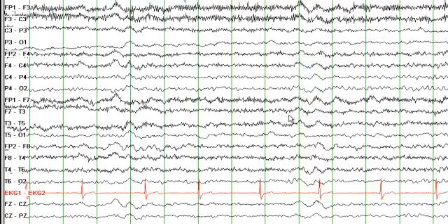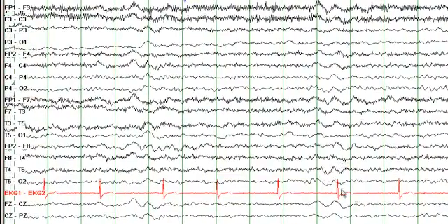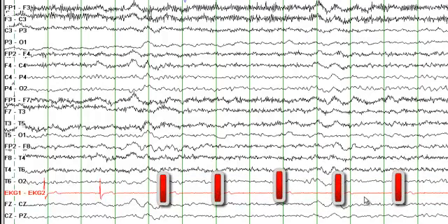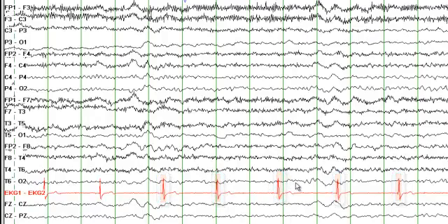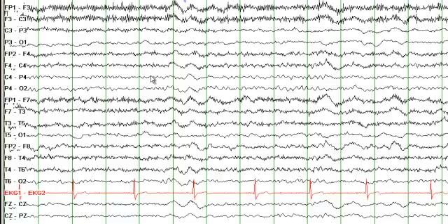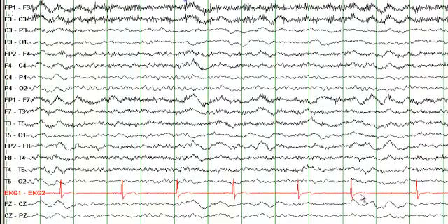The most striking thing in this EEG is to look at the ECG, which can provide information that may not always be available on the EEG. Let's determine the heart rate: count 10 seconds and count the QRS complexes, then multiply by 6. In 10 seconds there are 5 QRS complexes — 5 times 6 is 30. The heart rate at the beginning of the recording is just 30 beats per minute. This should make you suspicious whether something is wrong with the heart rather than the brain. The EEG shows slowing in both hemispheres, but the most striking finding is this very slow heart rate.